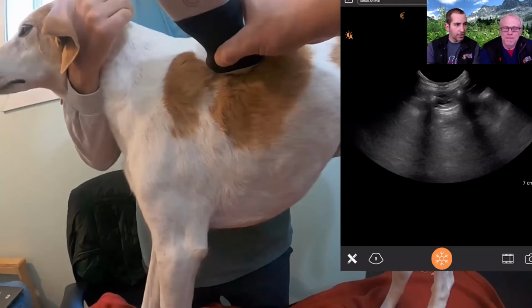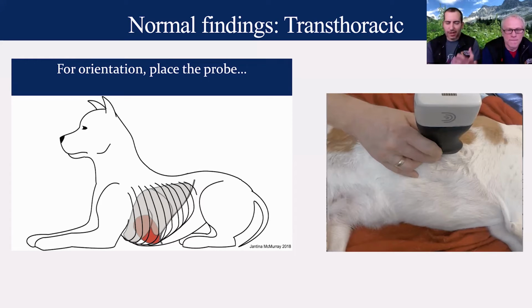Okay, that is very cool, Dr. Boysen. So moving on from that, we've got to think about how we're going to do this, right? We talked about a lot of things there, Dr. Boysen. I'm a little confused. I heard you talk about a glide sign, a curtain sign, a pleural line. My head's about to blow up here, Dr. Boysen. I need to start with step one.